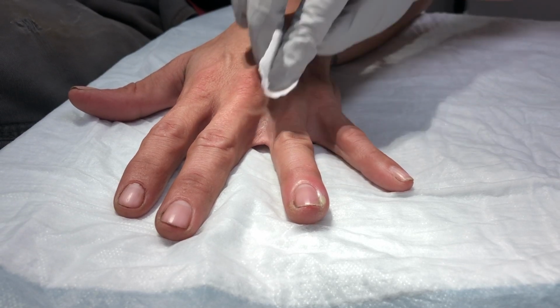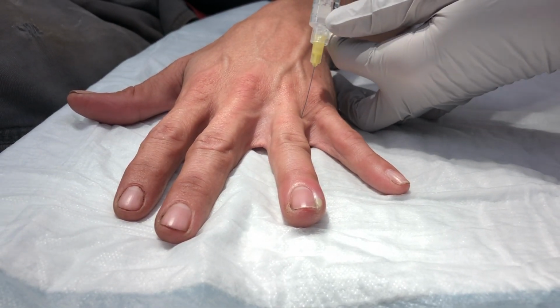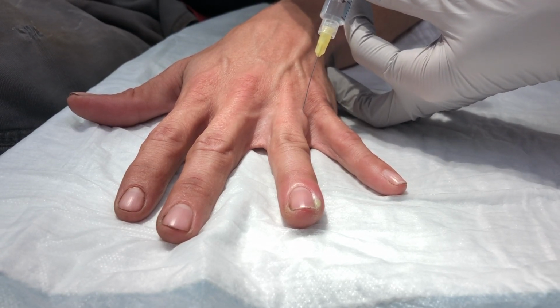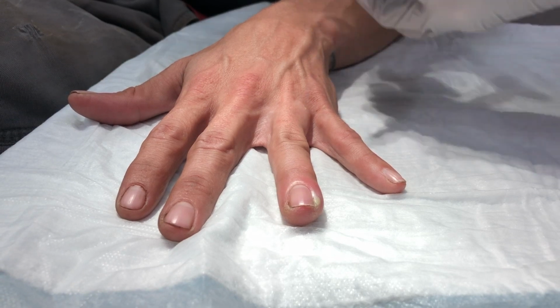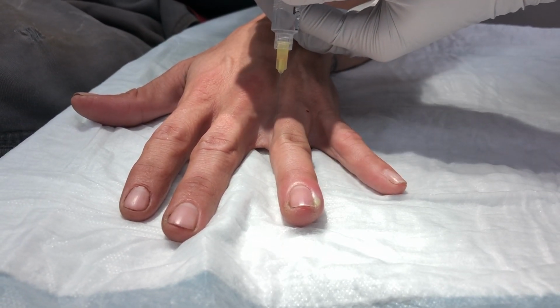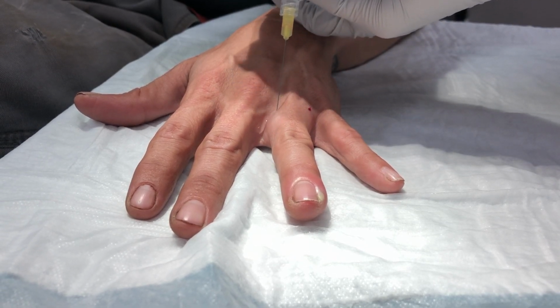The first step to performing a paronychia drainage is to appropriately anesthetize the digit. We performed a digital block using 1% lidocaine that is demonstrated here. The skin is first cleaned with an alcohol pad. Then, using a 27 gauge needle, the web space is entered at a perpendicular angle and approximately 1 cc of lidocaine is injected into each web space.